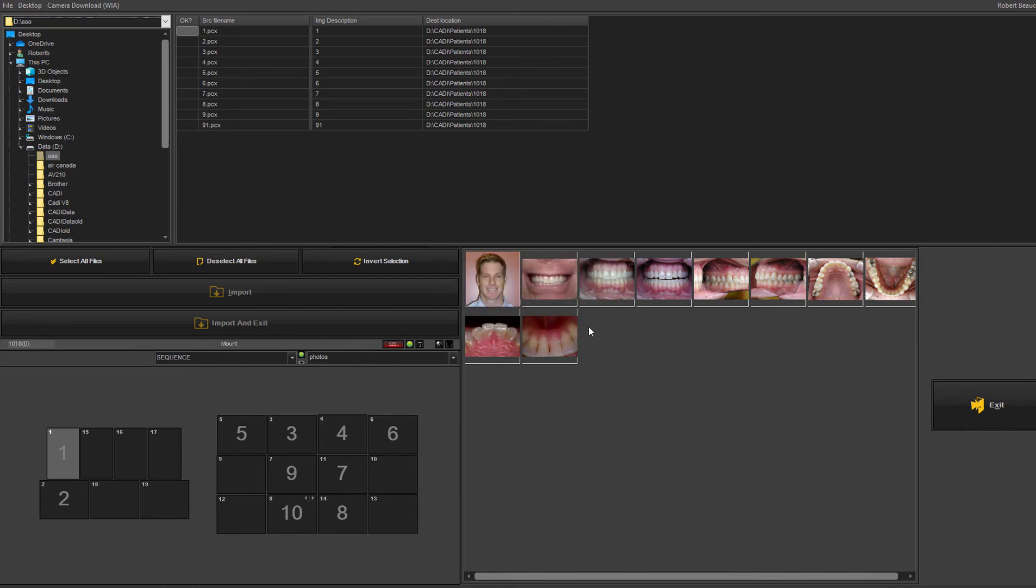So once this sequence is recorded and you're getting into this routine, it will remain the same and it will always again default back to the last used sequence so the computer knows. So what happens is it becomes a very simple, easy protocol for your staff.